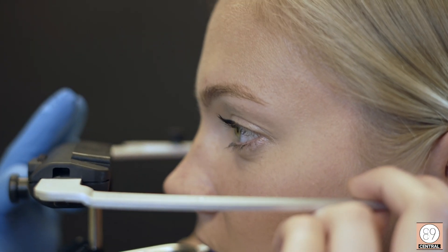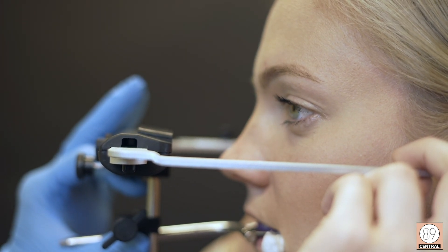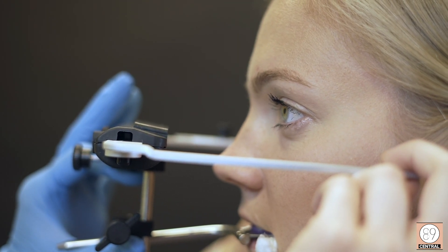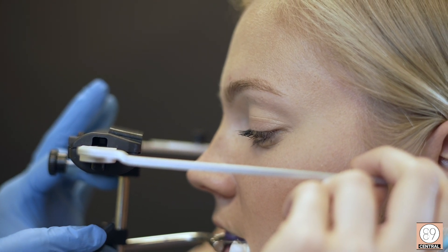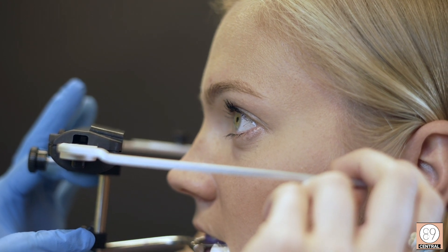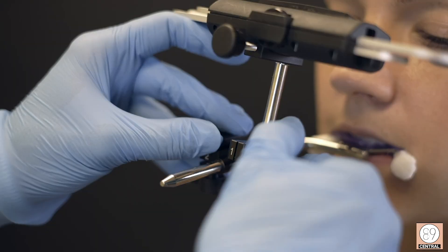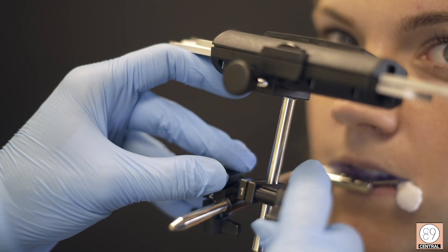We're using the orbitale as our reference point. You can use the reference pointer, but that can make a patient anxious. So what I normally do is look to the side of the patient and make sure that the face bow is lined up with my reference mark. We also need to make sure that the face bow is level — you can either use the interpupillary line or a level. Using a level will allow me to properly replicate the patient's cant on my articulator.